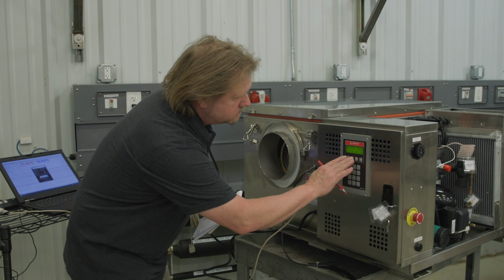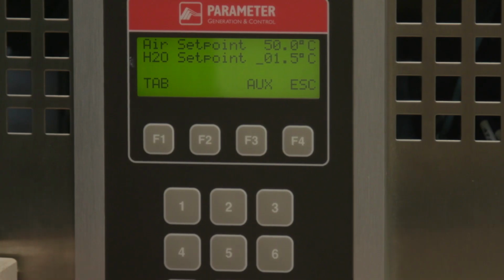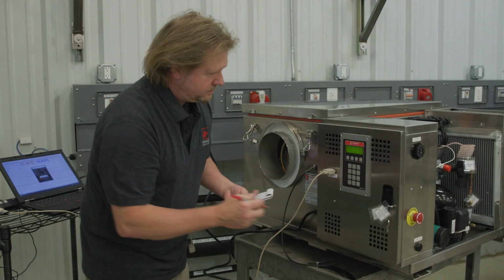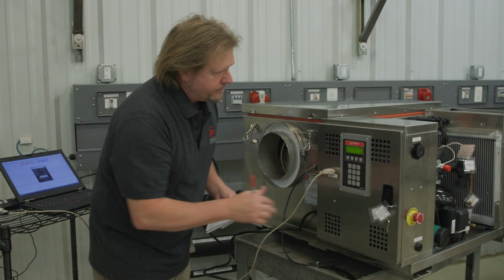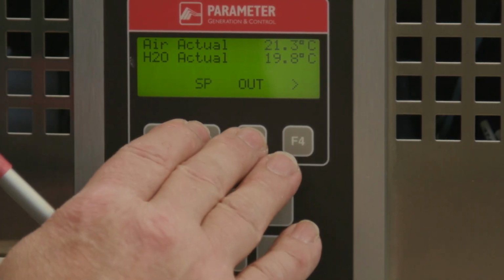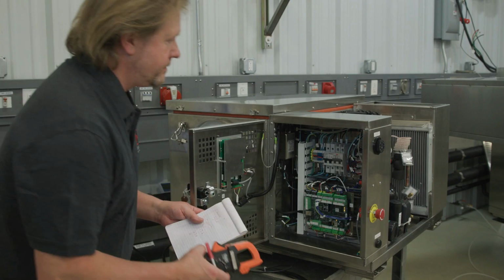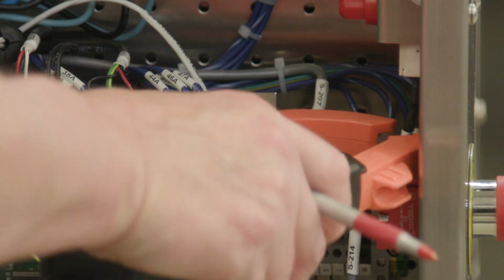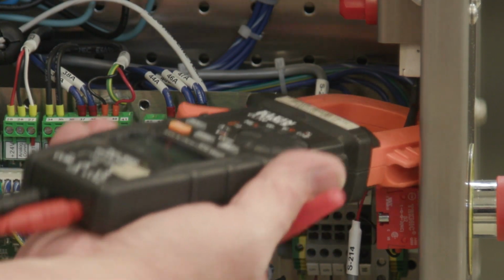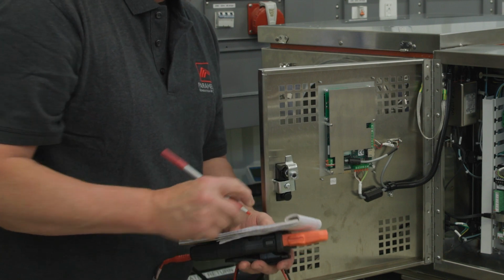Now we're going to verify the component functionality for maximum cooling. Adjust the water set point in order to provide 0% water heater output. Adjust the air set point in order to provide 0% air heater output. Air heater number 1 amps. Again, using a multimeter, check and record the air heater current for each air heater present. This time, the reading should be 0.